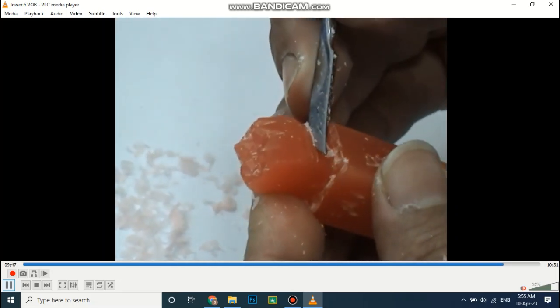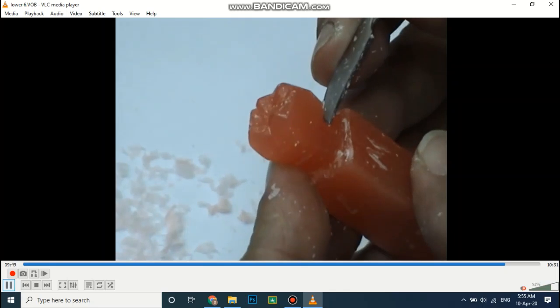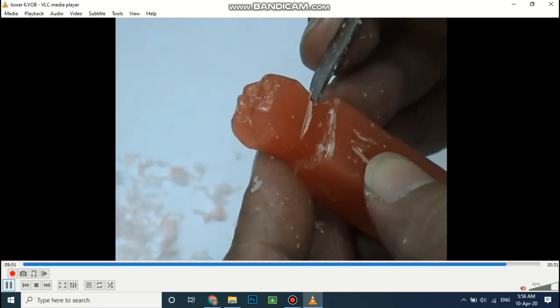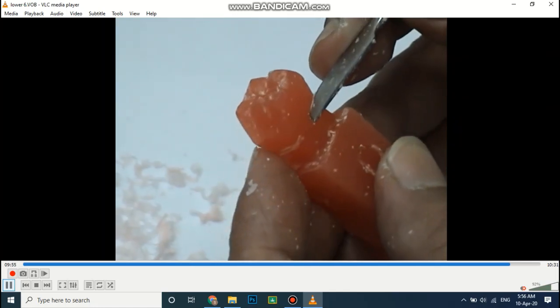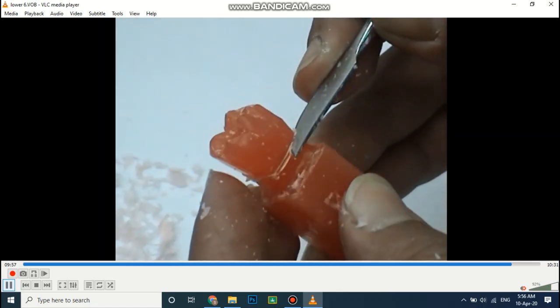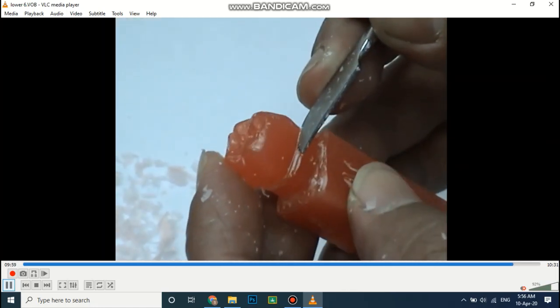Finally, we are doing the cervical line, which is convex rootwise buccally, slightly convex crownwise mesially, convex rootwise lingually, and straight distally.